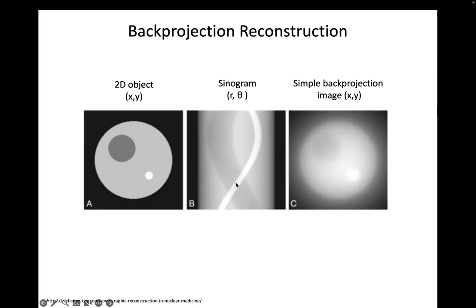And so here where they're overlapping, right here, in this P(R, theta), if I went through and said, oh, the bright source is right in the middle of the dark source in this one row, that must be this projection that goes through and puts this right on top.